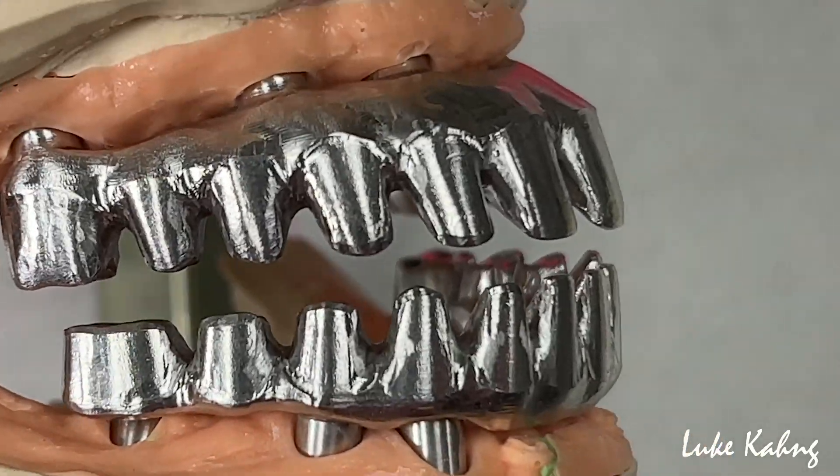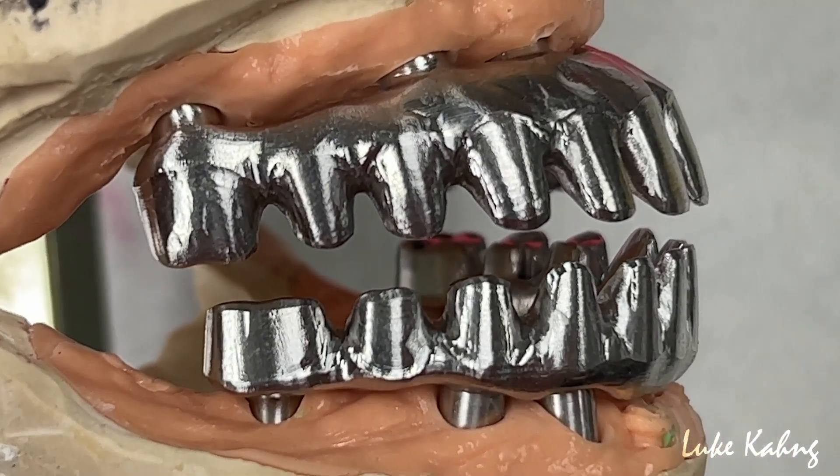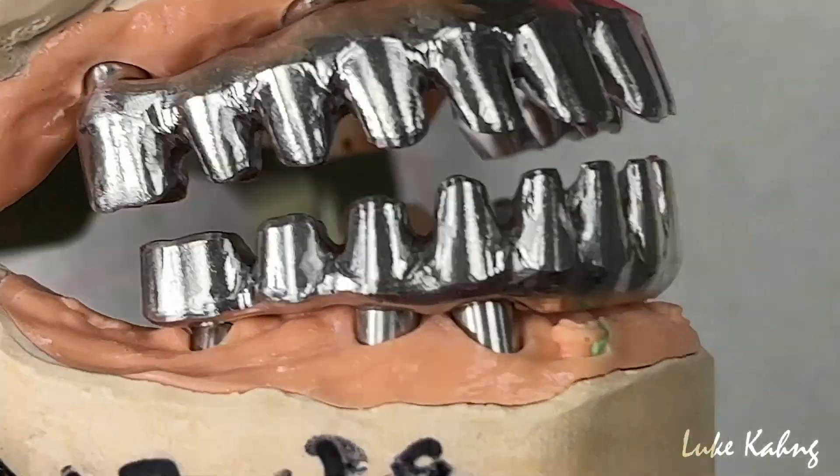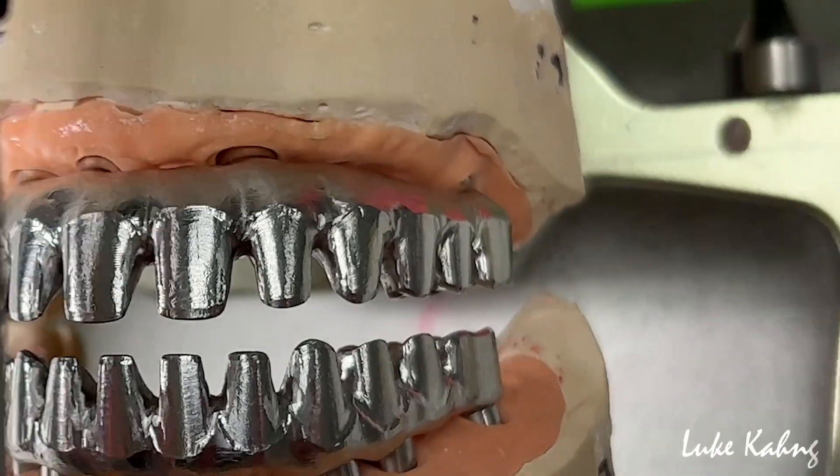So still we have a room for the final. It's a 4mm room for the occlusion contact, or 6mm — that's what I like.